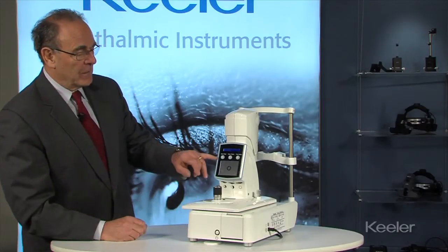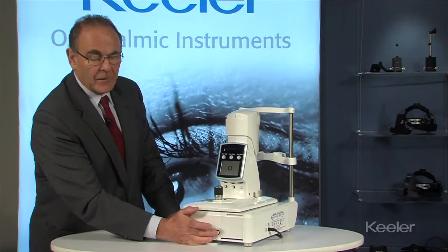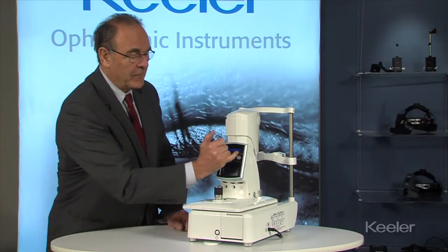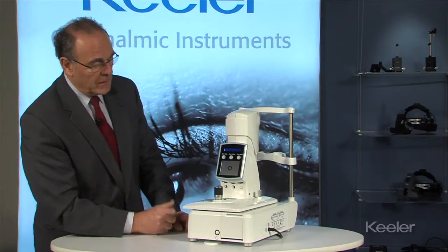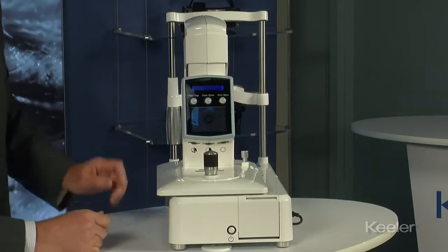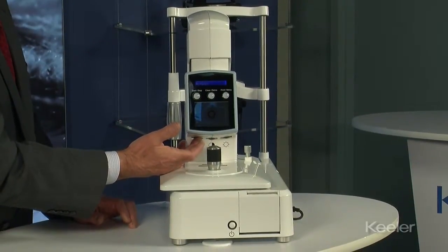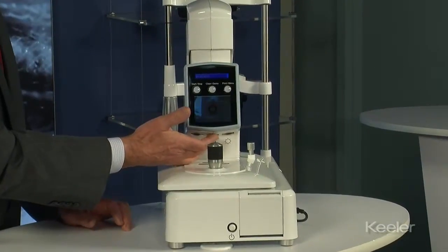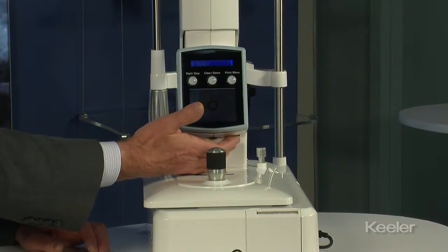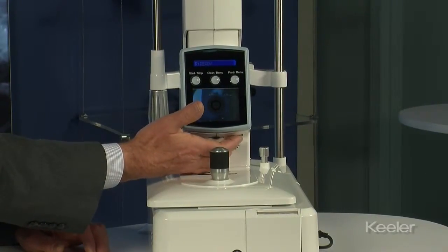Going to the operation of the instrument — once you've turned the instrument on from the main switch in the front, you have three operating switches here and three underneath for the screen. On this one you have the colour adjustment for the screen, the contrast wheel in the middle, and on the far right the brightness wheel for adjusting the brightness of the screen.